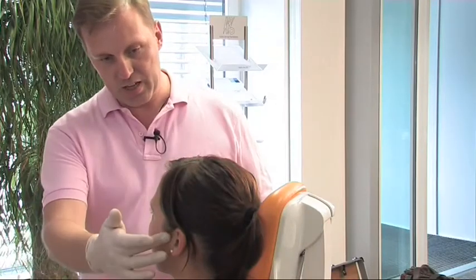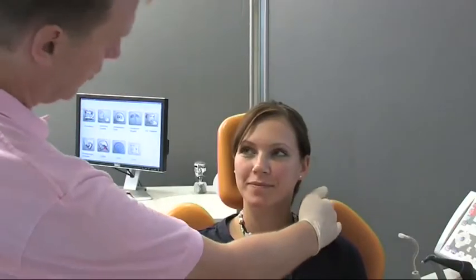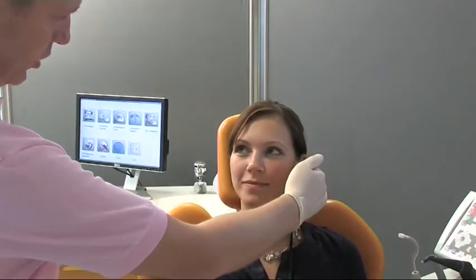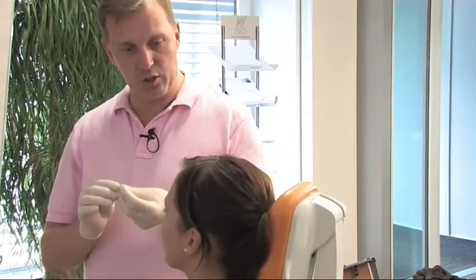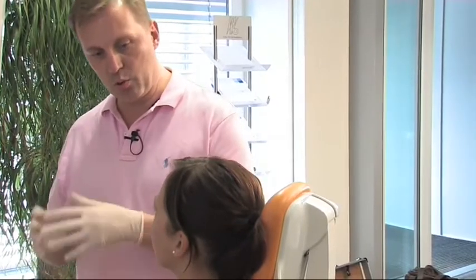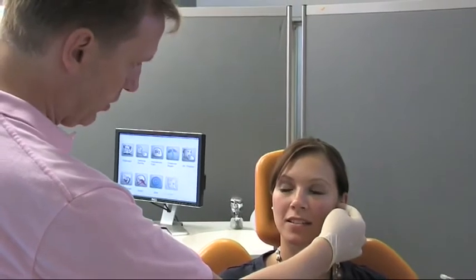There could be three reasons for this pain. There could be localized pain here, or it could be transmitted pain, or it could be projected pain from elsewhere. Or you were imagining the pain. Then we carried out an examination, and during the examination we determined that when you moved your jaw, or if we pressed here, we could reproduce the pain. We have here a localized pain. It is not transmitted, and it is not imagined. It is a factual somatic pain.